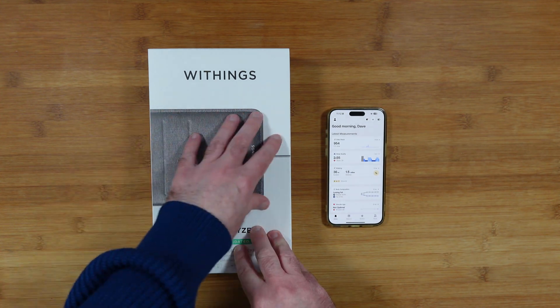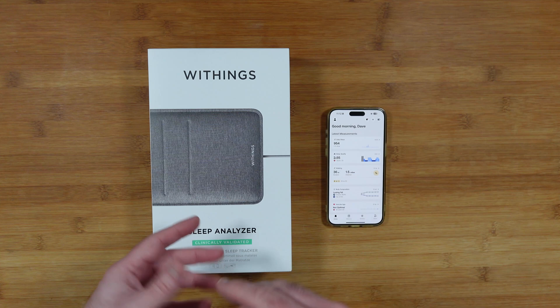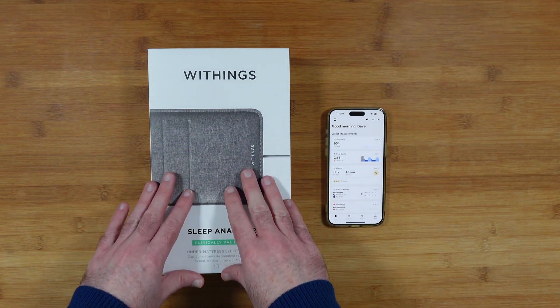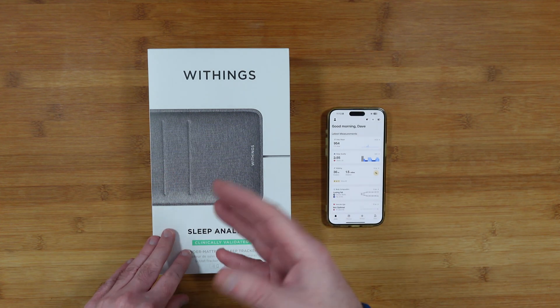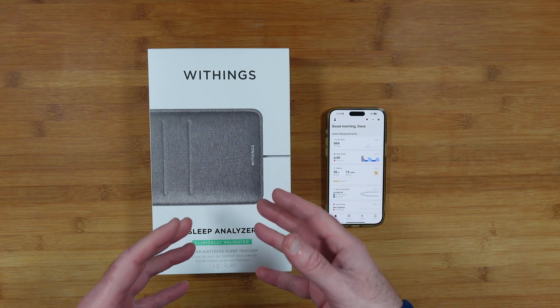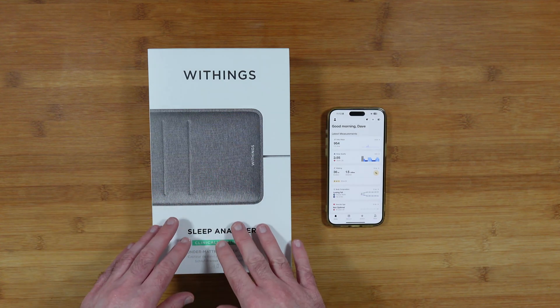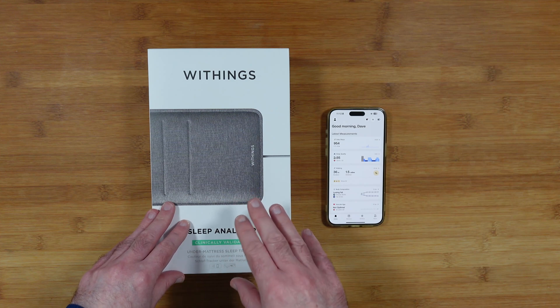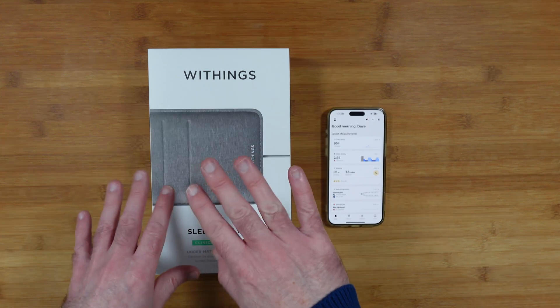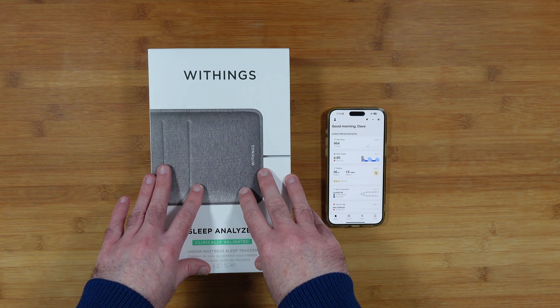Back to the Withings Sleep Analyzer — I placed the pad underneath my really thick memory foam mattress, which has multiple layers and is on the upper limit of mattress thickness that the sleep analyzer can work under. The first night it didn't gather accurate data. The second night I recalibrated it and set it to extra sensitive — only recommended when using it alone, not in a shared bed, as it can pick up a partner's movements. That night it gathered better but still unsatisfactory data. On the third night I placed it between my mattress and the mattress topper — the instructions do allow this — and it gathered much more accurate data.